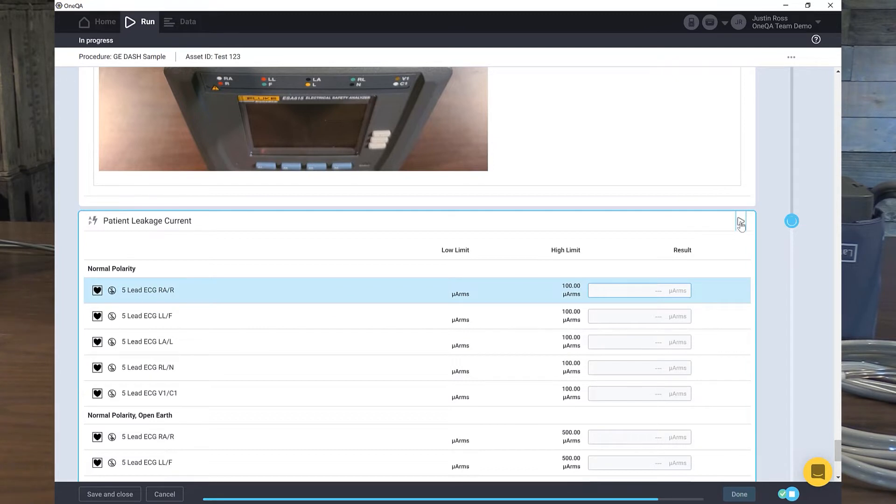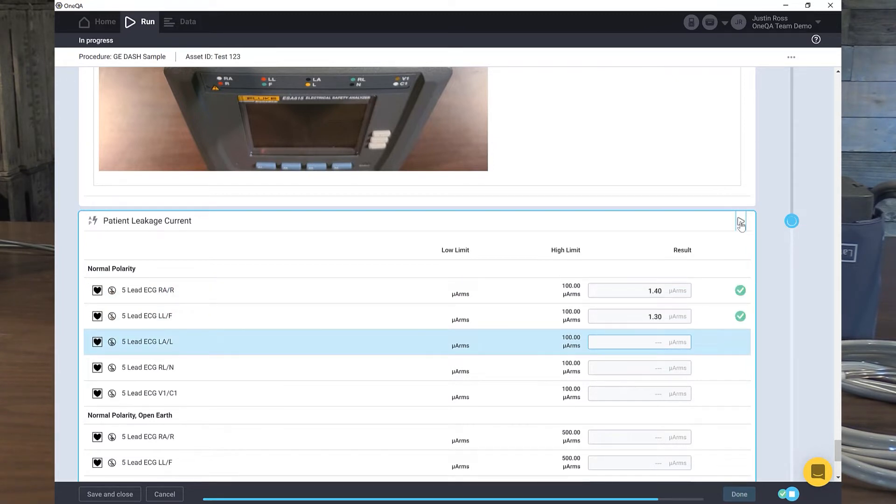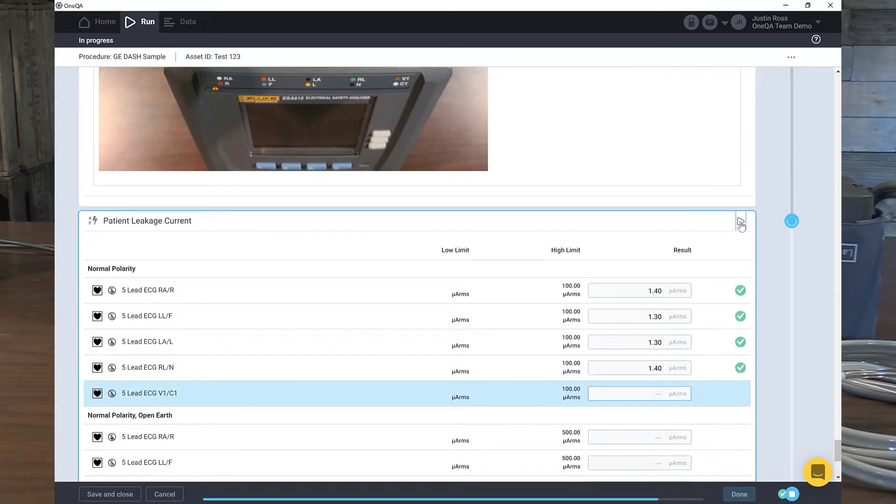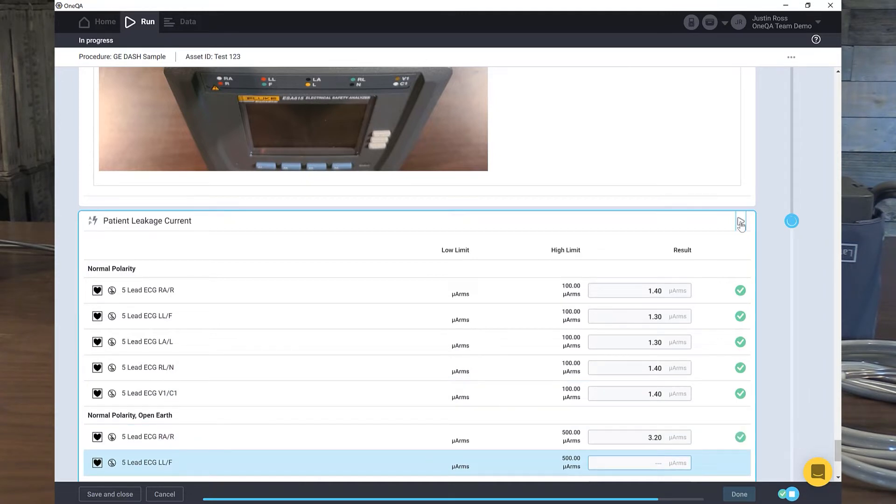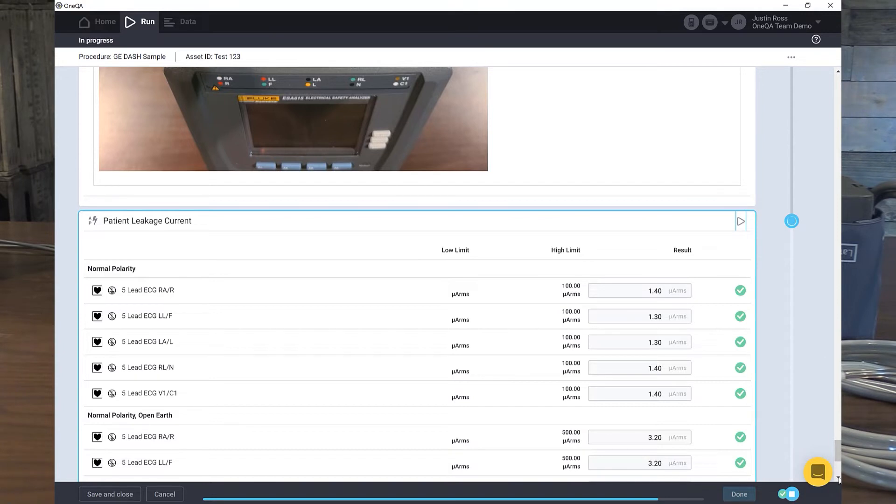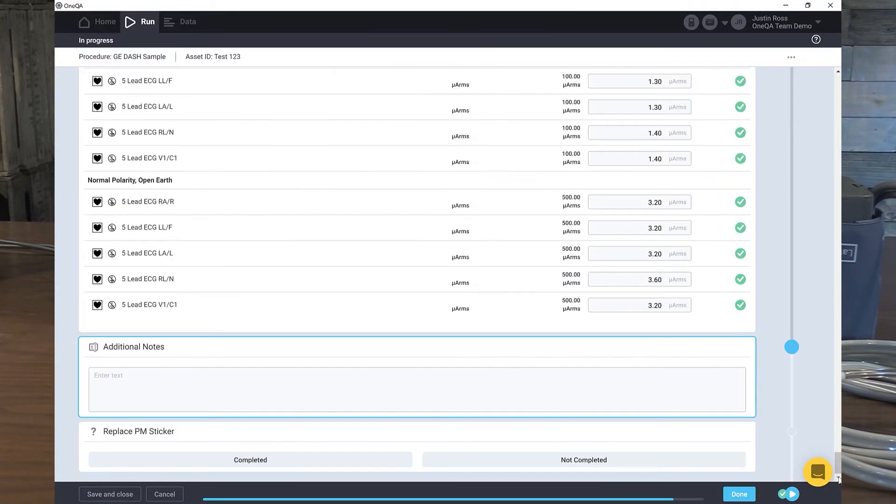Look at this. All this data is automatically populated. A lot of people make the argument that we don't want to do electrical safety anymore because it takes too long. But I'm not doing anything. The system is recording all these results for me automatically. So why not?